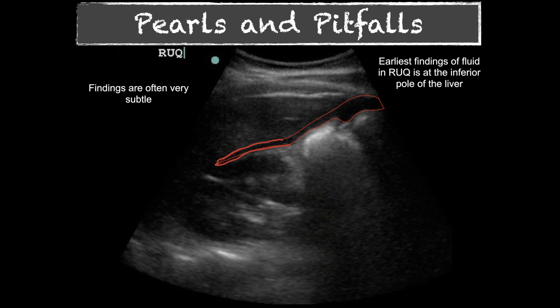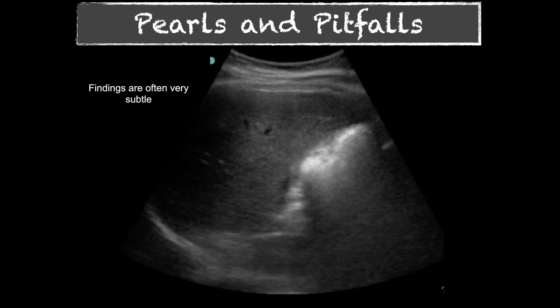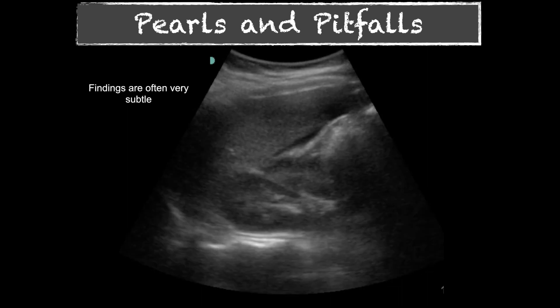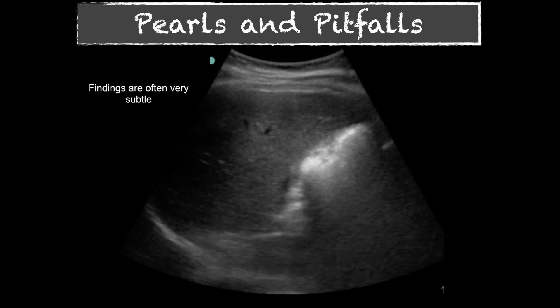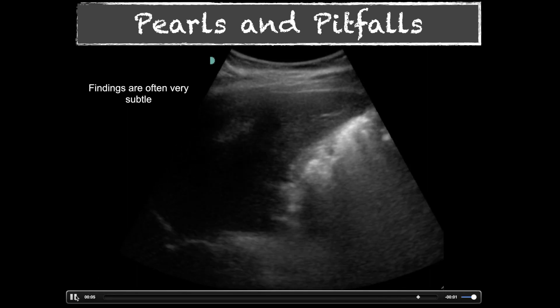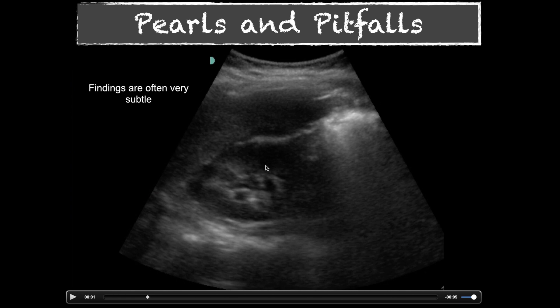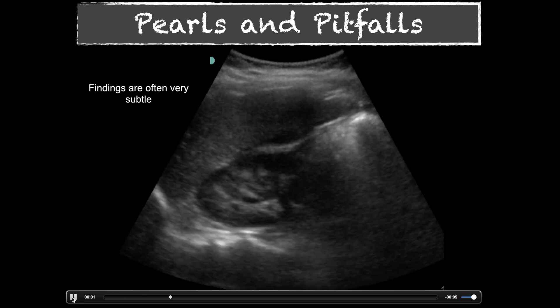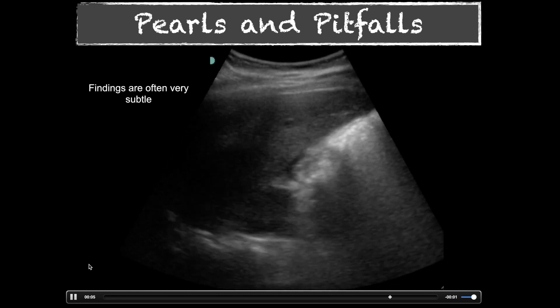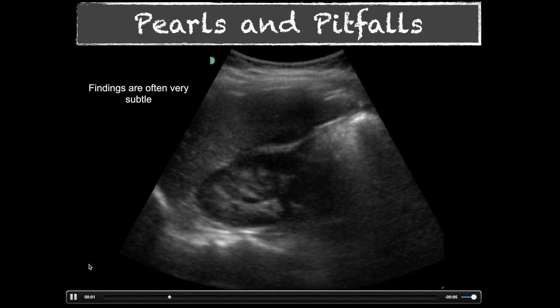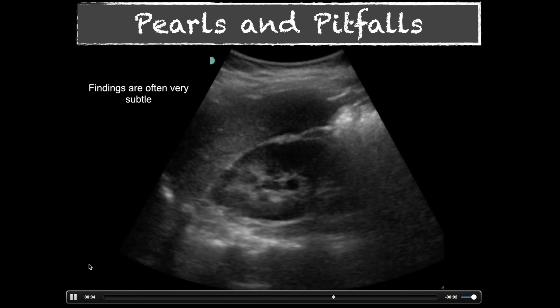Let's look at a video of the same patient. You can see the rib shadow here, and this is what we talked about — a rib giving us shadowing. You could get this image and call it a negative study when it's really not. As we fan through, we start seeing that fluid. That's why it's important to work around those rib shadows. Come down and get the inferior pole of the liver as we saw in the prior example.